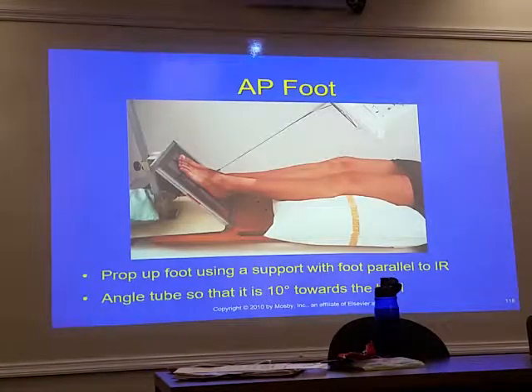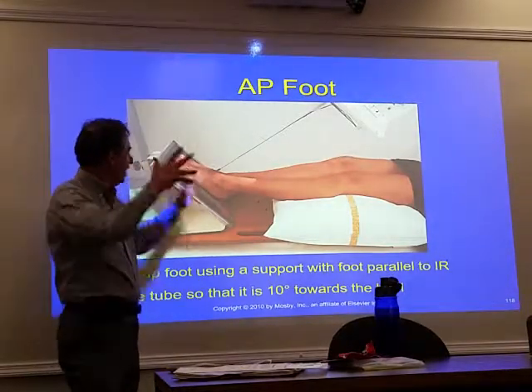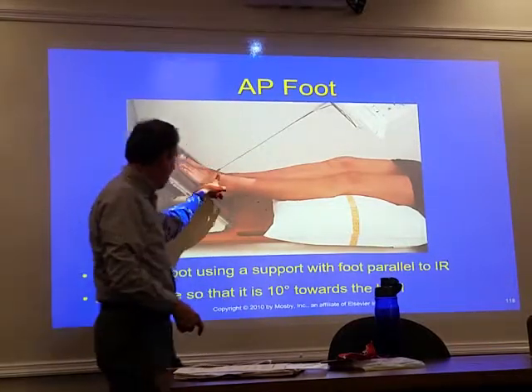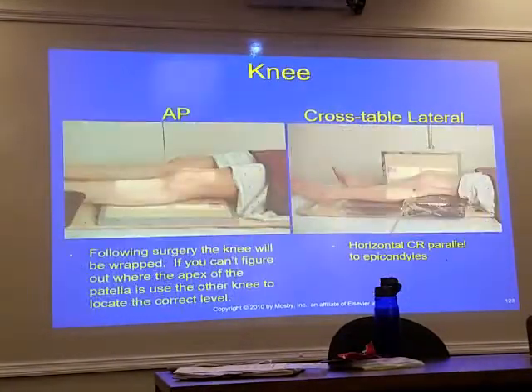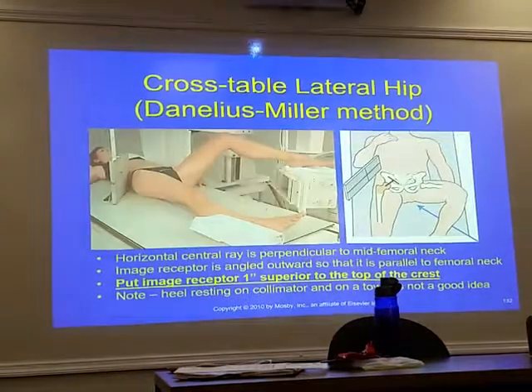We had talked about this just the other day: always keep in mind where the angle of the foot is, and if you have to improvise because the cassette is up, in this case I might be angling down more this way rather than across here. But again, you're probably a little bit more familiar with that already, okay? I don't think there's that much else that I really need to go over.